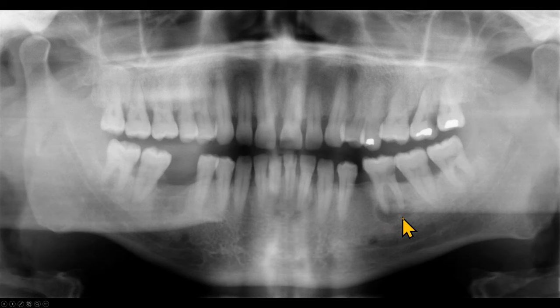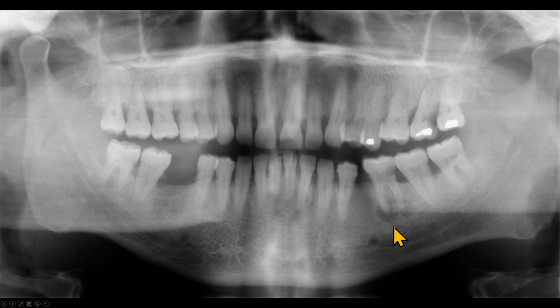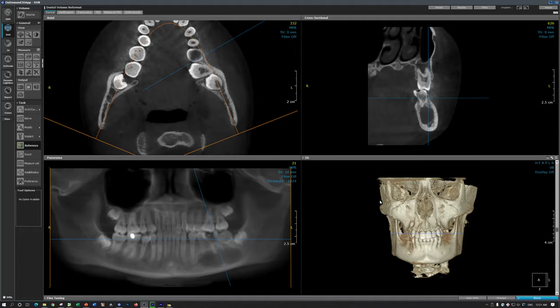Let's look at another radiograph. Again we have a lesion with the mandibular left first molar. This tooth has a large carious lesion on the distal aspect. The radiolucent defects are arising from both roots. The margins are not corticated.